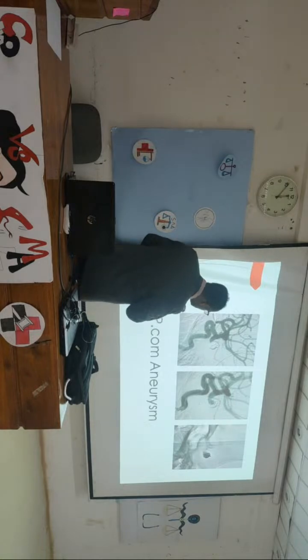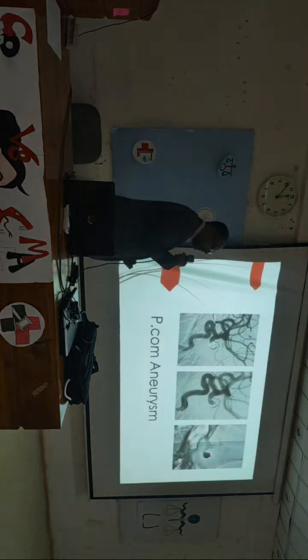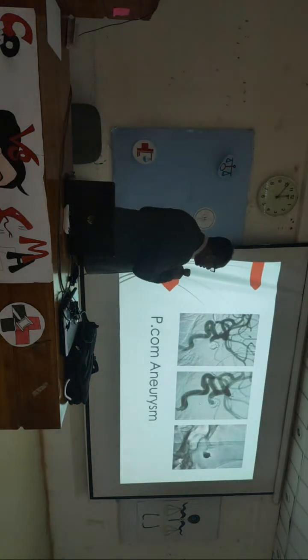This patient, four years ago, presented with severe headache, and we did a CTA and angiogram, which revealed a posterior communicating aneurysm. At the acute onset, we did partial coiling to prevent rebleeding because it is a wide neck aneurysm. And here we did partial coil. And then after 3 months, we go and put a stent to treat the rest of the aneurysm.